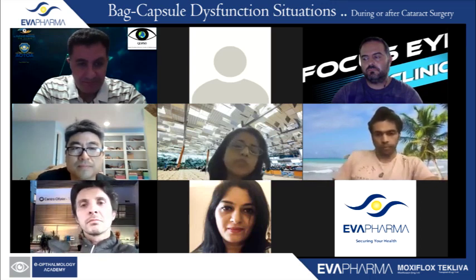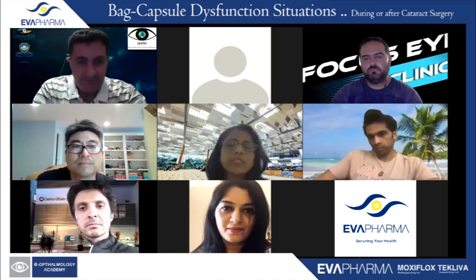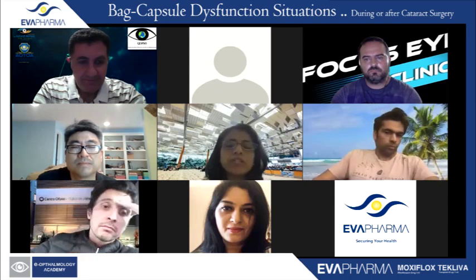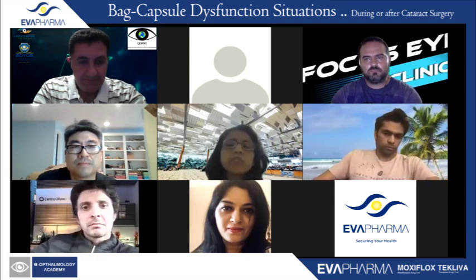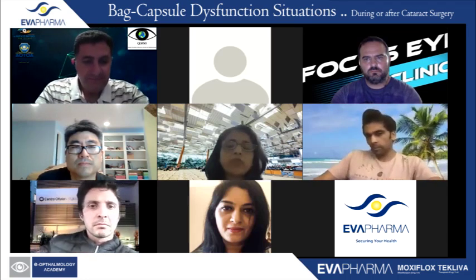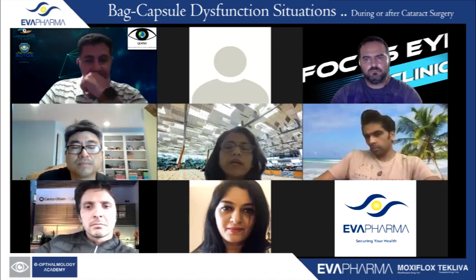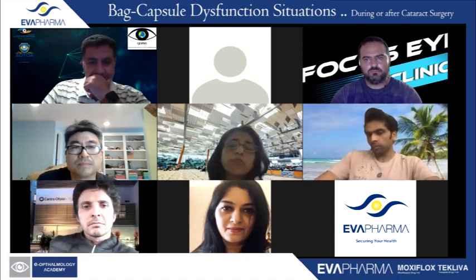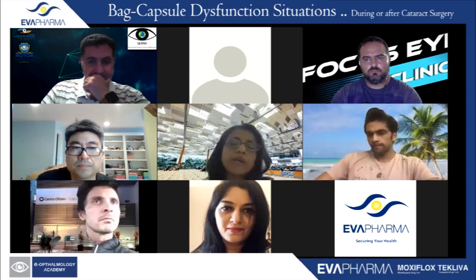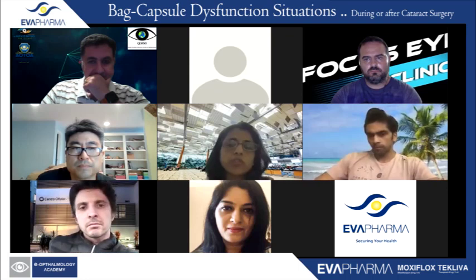This would be useful in situations where you have a subluxated cataract, where you haven't really entered the vitreous and there's no big indication for entering the vitreous. The other option would be maybe to do a lensectomy. Now, if you do a lensectomy, you're doing it in an open eye without any support, unless you do the glued IOL scaffold technique or one of the scaffold techniques. Otherwise, your nuclear fragments can just fall down into the vitreous.